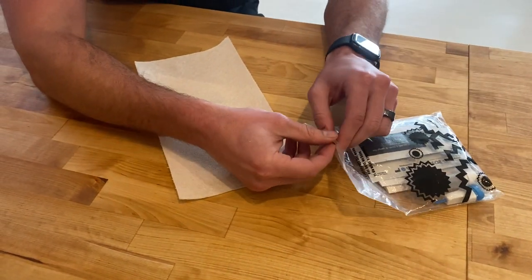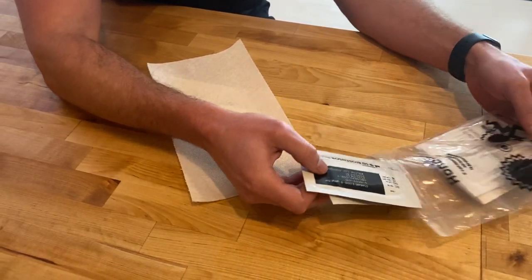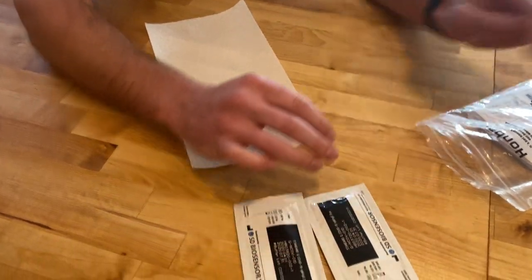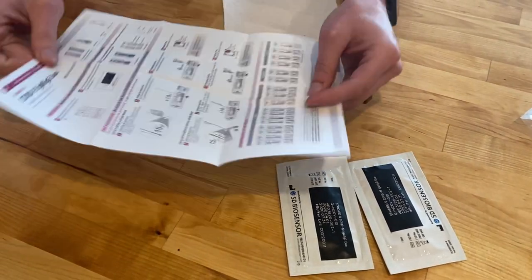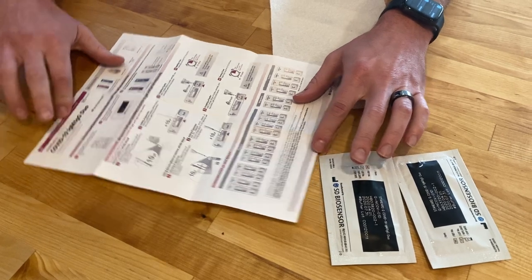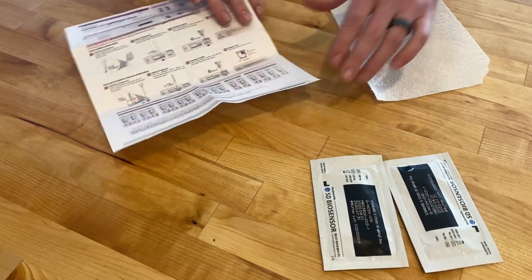One thing you'll want to do whenever you get out your test kit is just identify everything you're going to need as you get started, so you're not scrambling after you poke your finger. You're gonna have two separate test kits, and an instruction packet that comes with the test kit itself with step-by-step directions on how to collect and the timeframes you need to use for each of the steps. We'll walk you through this — there's no need to look at it closely right now.